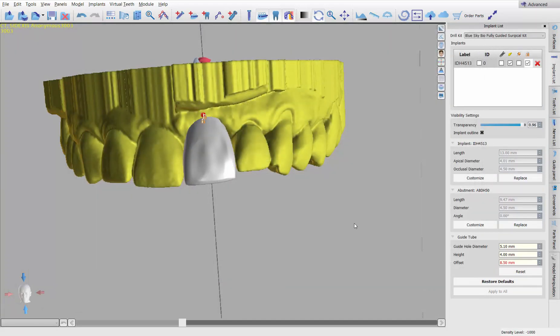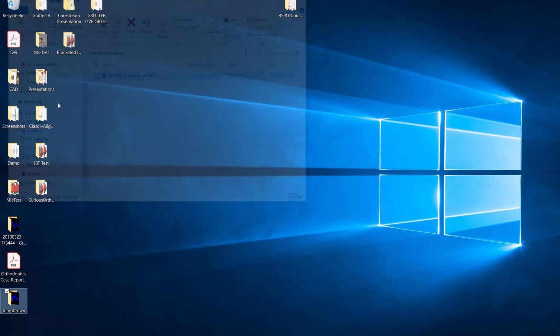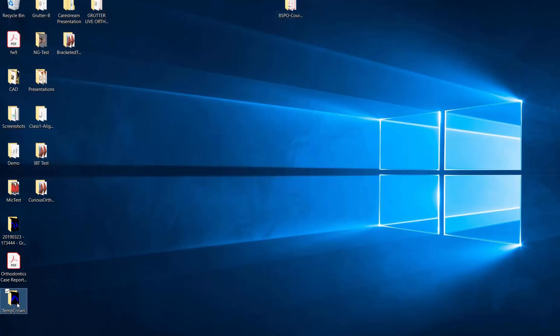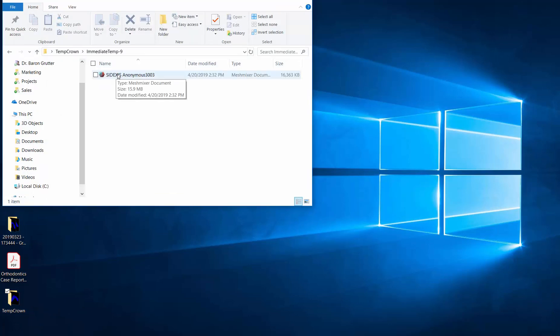Now if I had had an opposing model, I would have exported it as well. So just keep that in mind. I don't have it in this case, but I would use that if I was going to be using opposing occlusion and whatnot. So go ahead and minimize this. And here is this folder right here. Go to temp crown. This is the immediate temp nine. Here is the STL that I just exported.